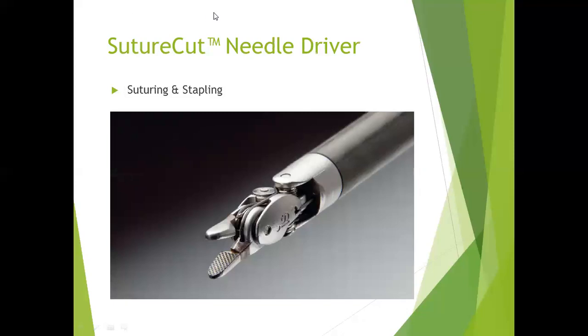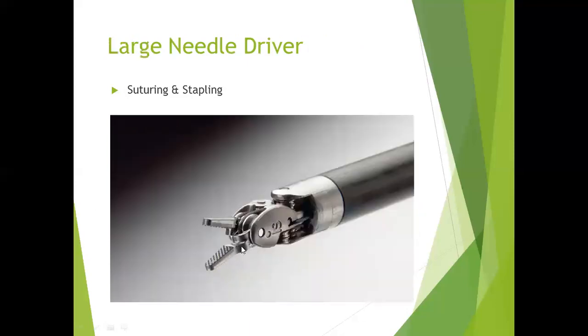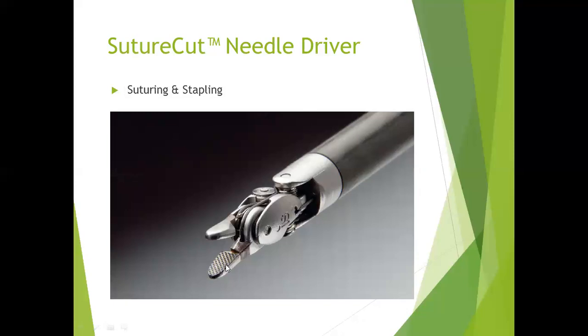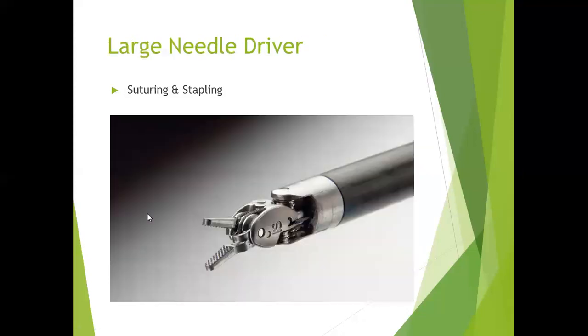Suture cut, again, another name. You're going to have to put suture cut needle driver, not just needle driver, because there's another type of needle driver. So look really close at this part when you look at suture cut. Large needle driver, there you go. It doesn't look that much different. Let me go back. That's the suture cut. See how flatter it is? That's the large. See, it's a little different in the jaws.